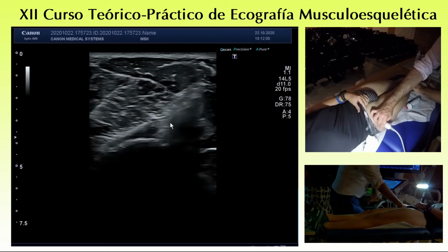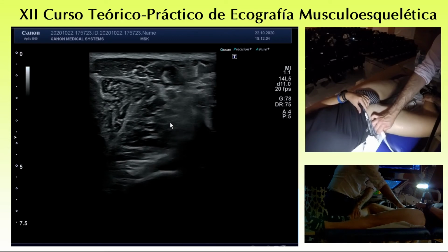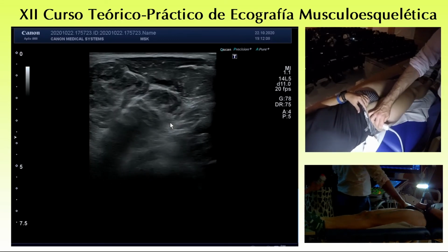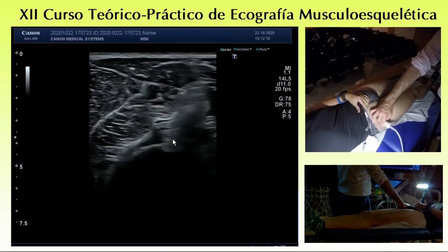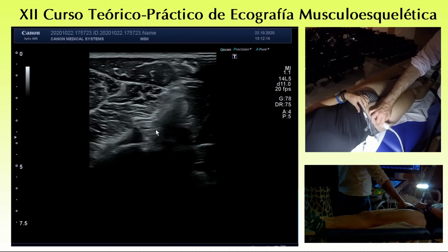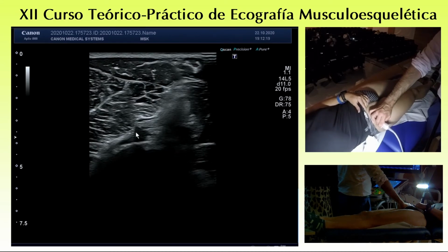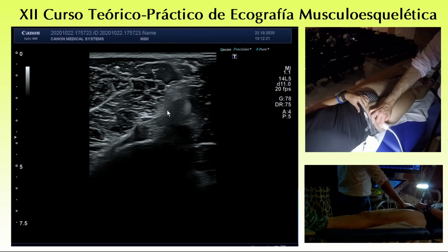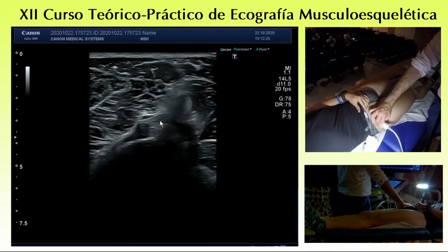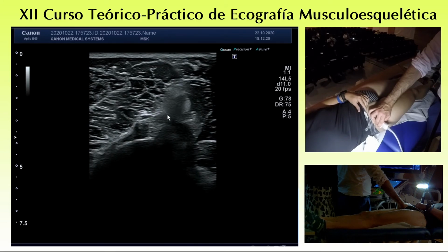Try to put the angle in just a normal, neutral position. Thank you. Yeah, sometimes just become less tense. Okay. You see here, you make a kind of notch in this point because it's more relaxed. You see, you do like this, and here a kind of notch in this point, just to show the difference according to the leg inclination.